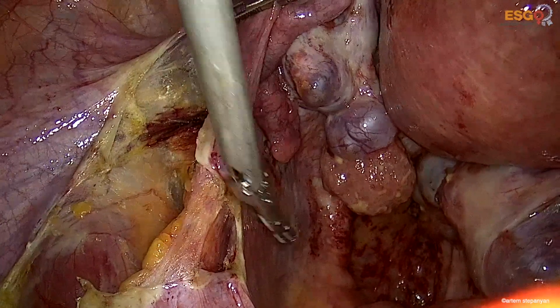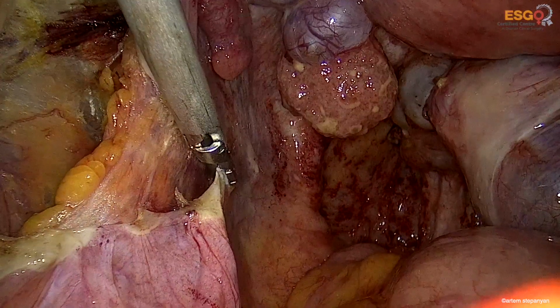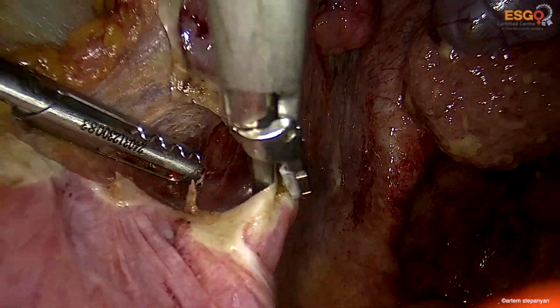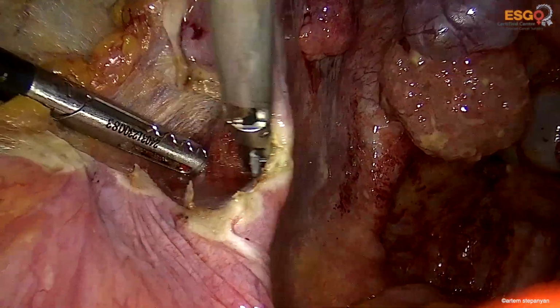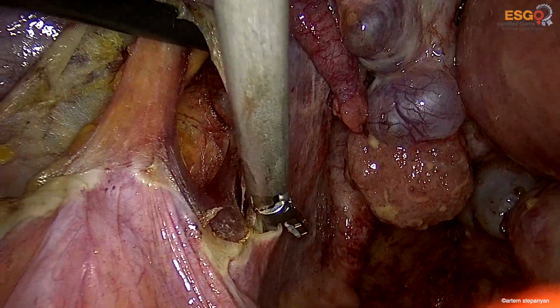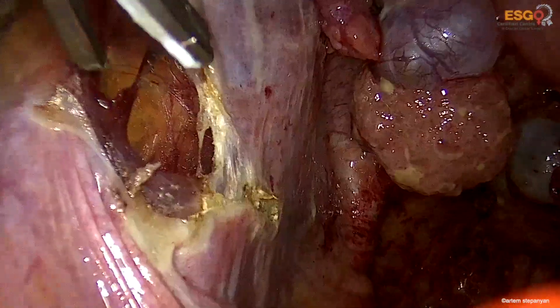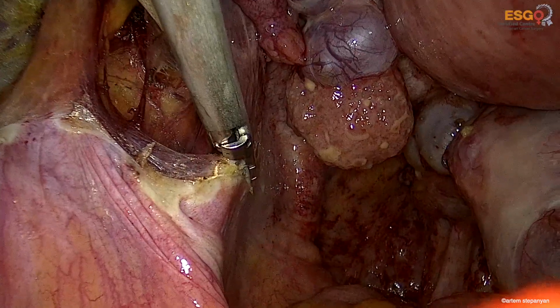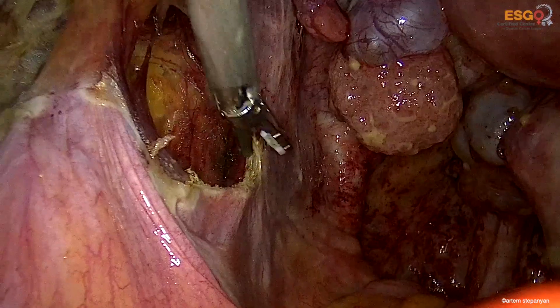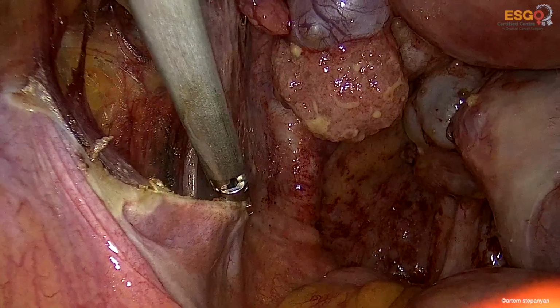Here we see the vessels are isolated. So we have the vessels isolated, the ureter isolated, and the nervous structures isolated. So now we can demarcate the peritoneum to be removed without any risk of damaging the underlying structures.